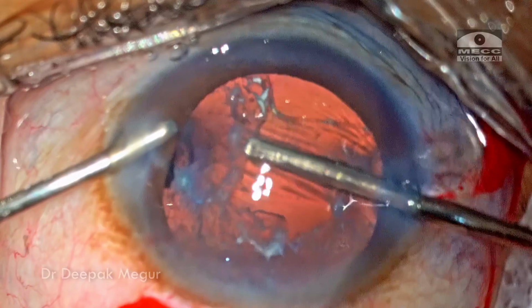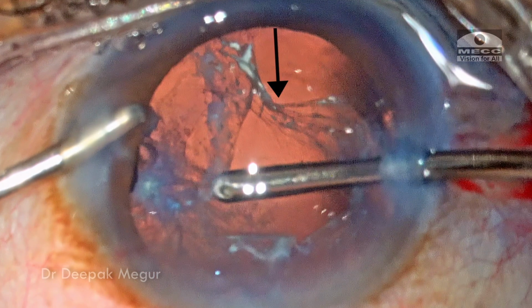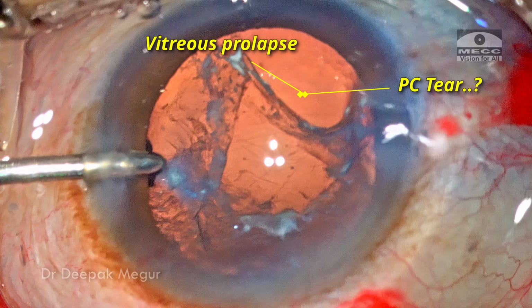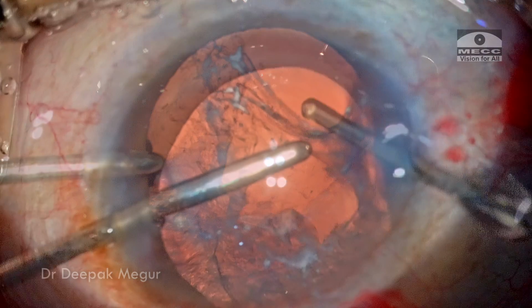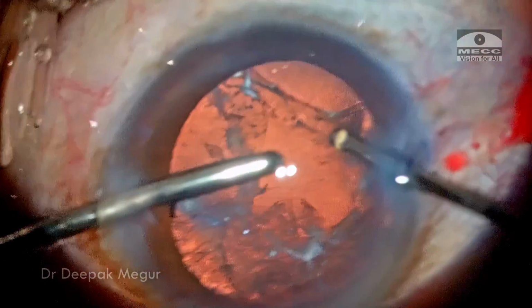But as I'm doing this, we can clearly see that the equatorial breach which was there in the capsular bag has folded inward, increasing the size of this clear area, indicating that there is a fresh prolapse of vitreous. So this is a clear sign that I need to go back again with the vitrectomy cutter to deal with this prolapsed vitreous, because that is what has pushed this bag into the central region. I go in with my cutter and then perform a limited anterior vitrectomy.